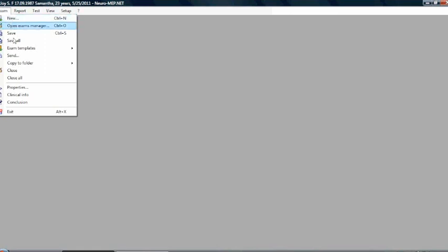So one thing you're going to have to decide early on is if you want to work with templates or if you want to work with nerves as you decide which one you want to do, or muscles. Let me explain briefly what a template is. Basically, let's go here under exam and say exam templates. When we send you the machine, it's going to come with preset templates for upper extremity conductions, lower extremity conductions, upper extremity EMG, lower extremity EMG. Let me explain what that means.